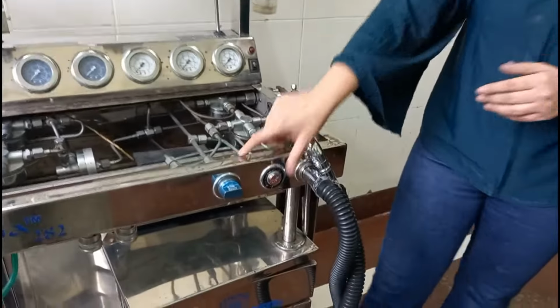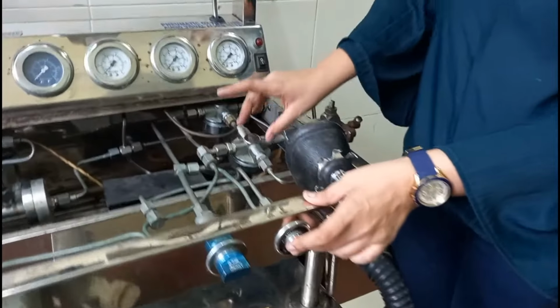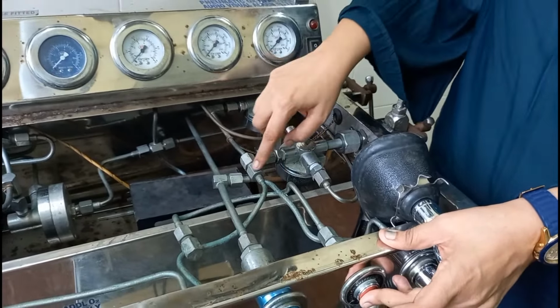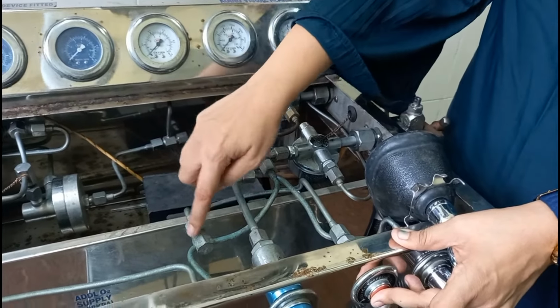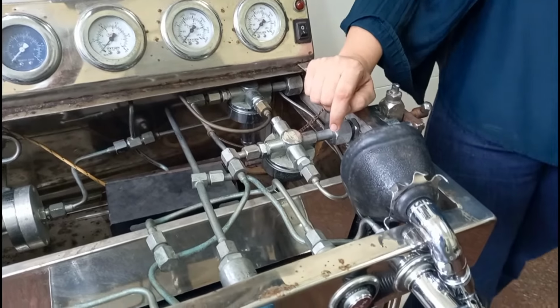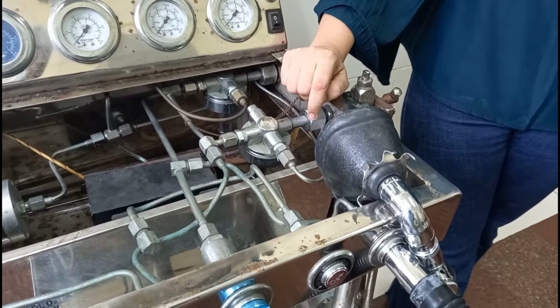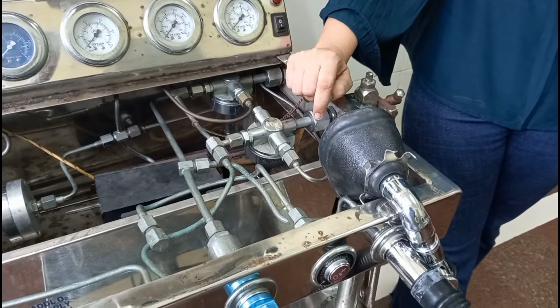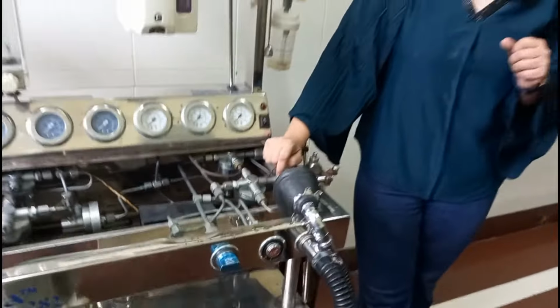Here there is the oxygen flush valve. As we can see, the oxygen is coming from here. This is the pressure regulator from which it is going. After this is the oxygen valve through which it is having a flow of 35 to 75 liters per minute. Oxygen flush valve is very important for emergency situations when the patient is desaturated. But there are many hazards of oxygen flush valve.